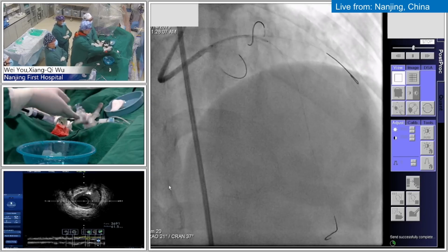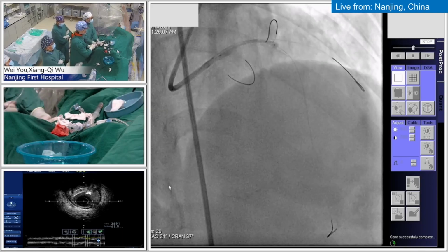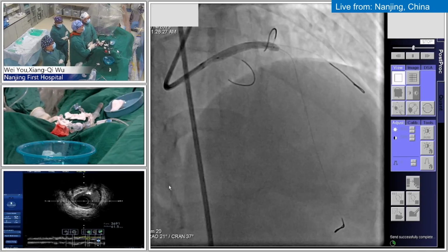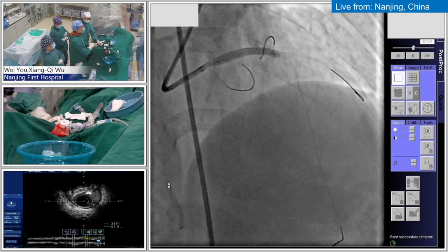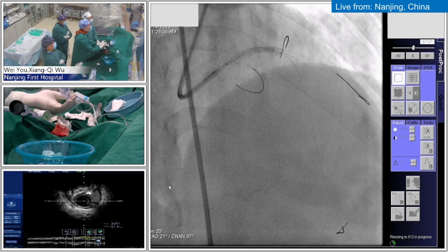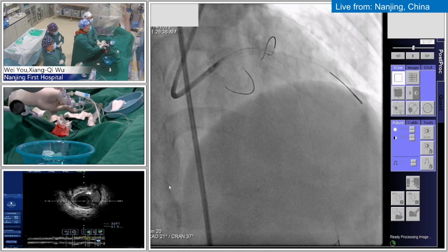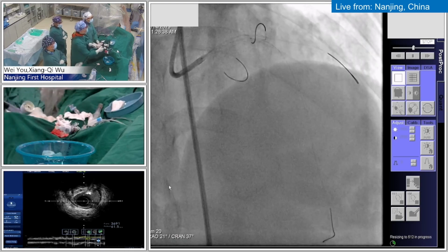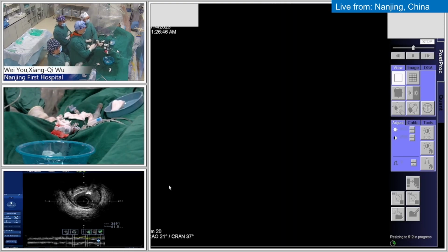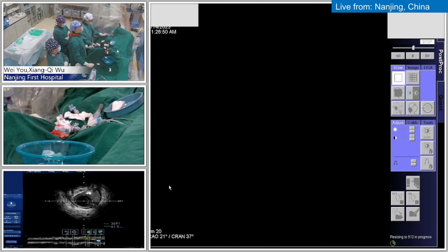Okay. Go. Yeah. So by the standards of First Hospital, Nanjing, I bet you this is one of their simplest left mains they have done in a long time. Yeah. And not to jinx any of these things, you require all sorts of care in selecting, and we'll take you through the approach of bifurcation stenting at Nanjing.